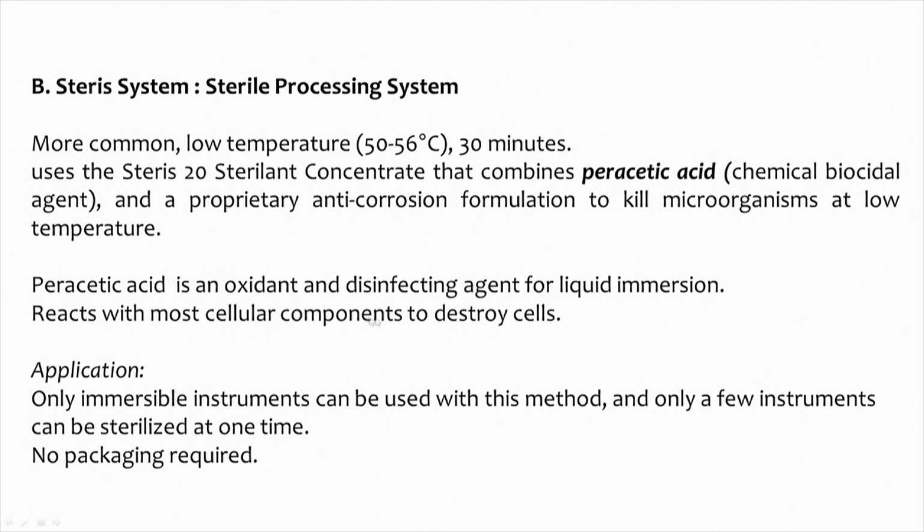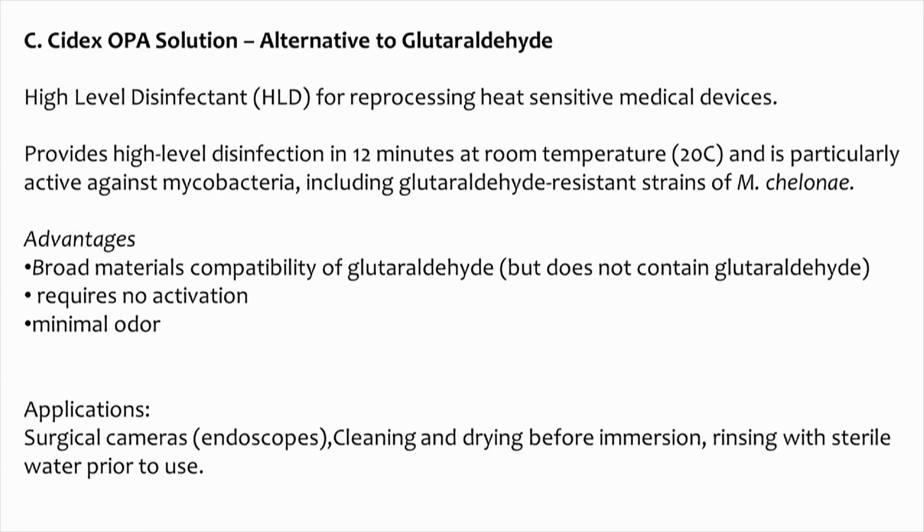It reacts with most cellular components to destroy them. So it is a sterile processing system using peracetic acid. What we do is immerse the material or the instrument, and if the material cannot be immersed, then we cannot use this method. We do not need to have a packaging for the material also. So it has got some disadvantages.